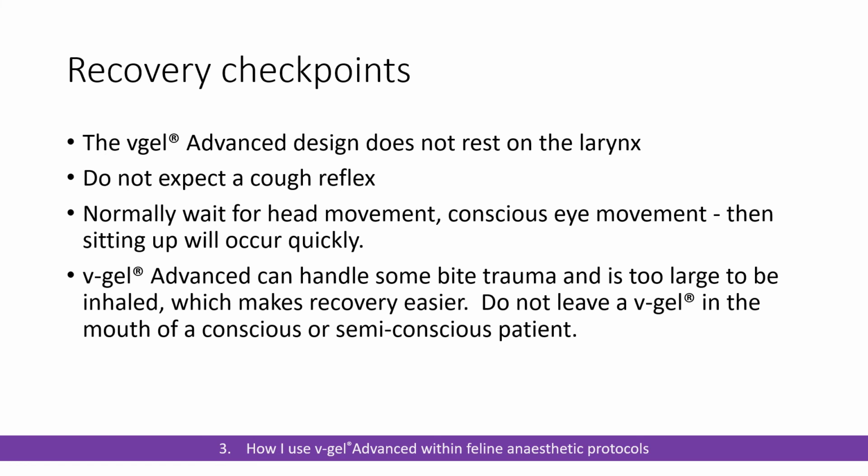So if that patient was to wake up very quickly and bite down on the V-gel, it's unlikely that they'd cut it in half, and it's certainly impossible for them to inhale it. But having said that, I wouldn't suggest that you leave a V-gel in the mouth of a conscious patient. They're quite likely to panic or stress because of this thing that's in place in their pharynx.